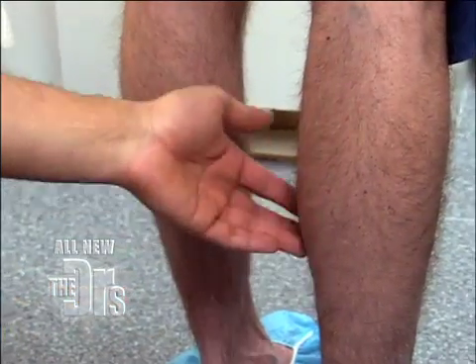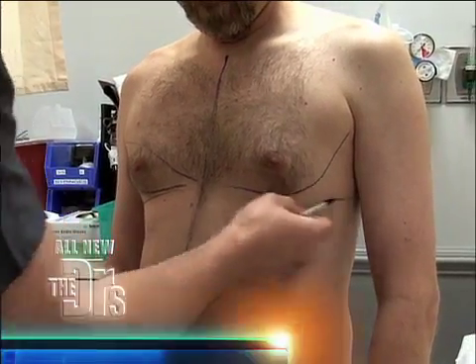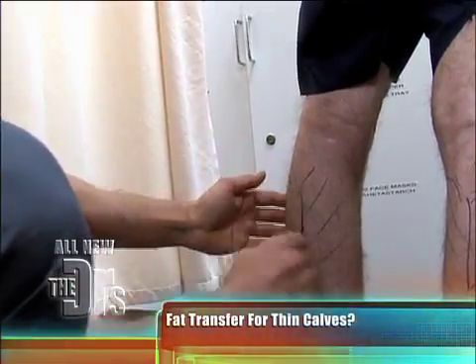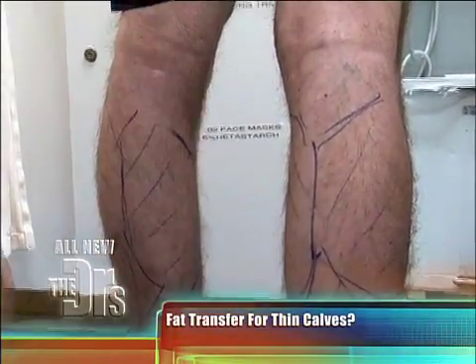So what we're gonna do today is augment this fellow's calves. I'm gonna have to mark the areas we're gonna actually take the fat from, and then we're gonna mark the areas we're gonna put it back in. I'm gonna take a little bit off of this area as well. The shape of your calf is not bad — you have some definition here. Tom is an ideal candidate because he does have skinny calves. That's the most important thing. And he has a little bit of fat to donate. So we're ready to go.